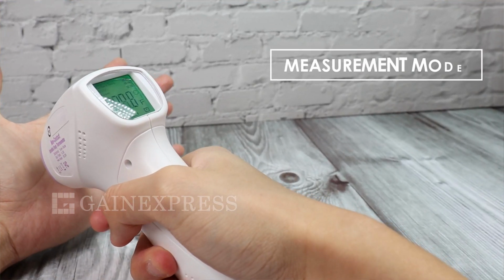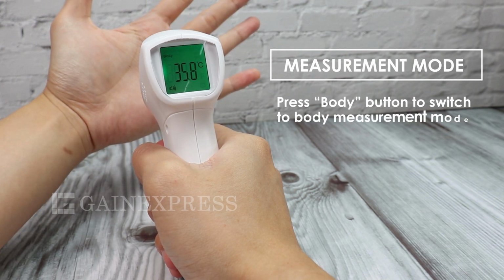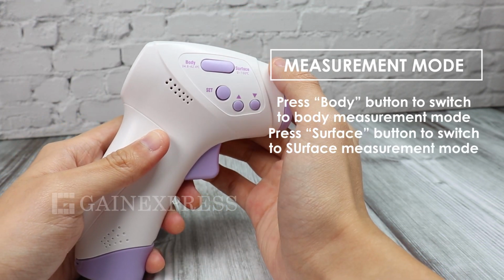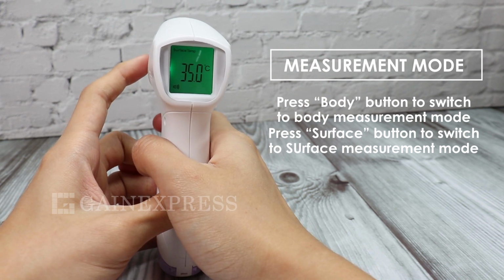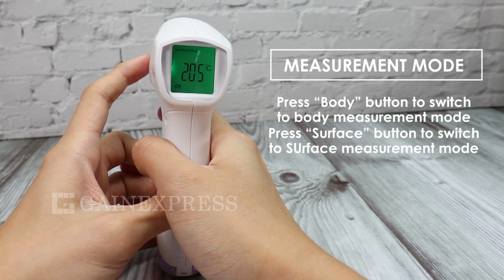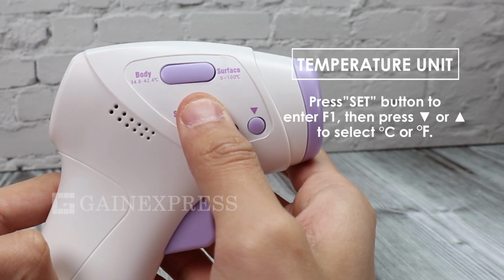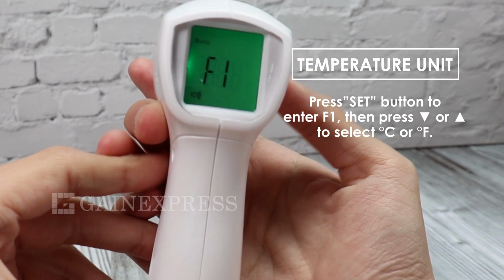To change the measurement mode, press the body or surface button. For temperature unit, press Set button to enter F1, then press the up and down button.